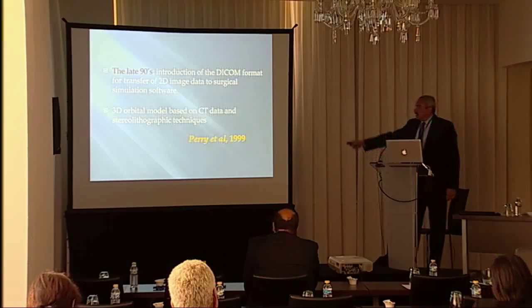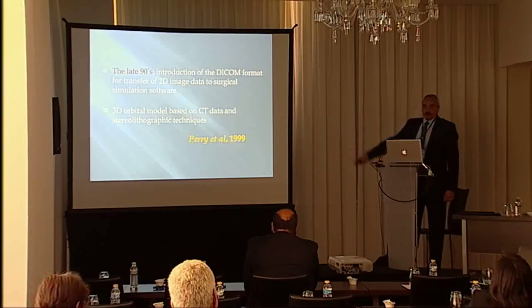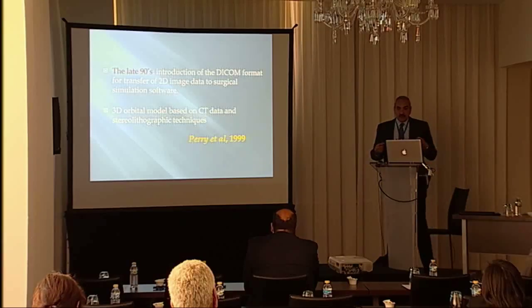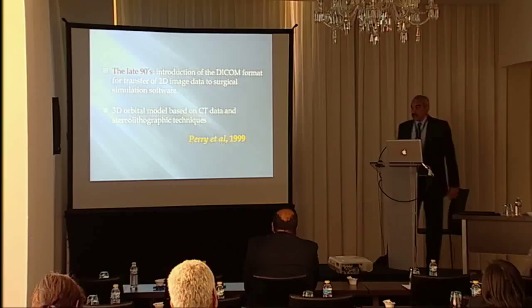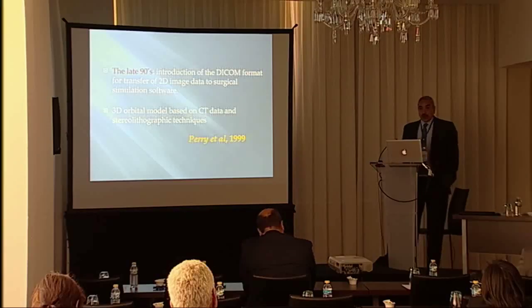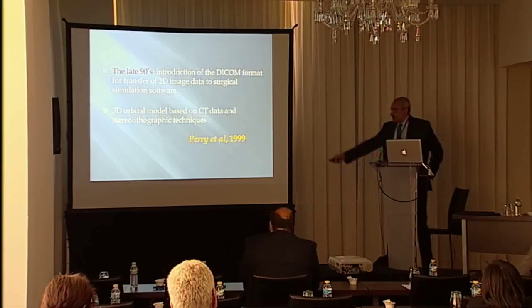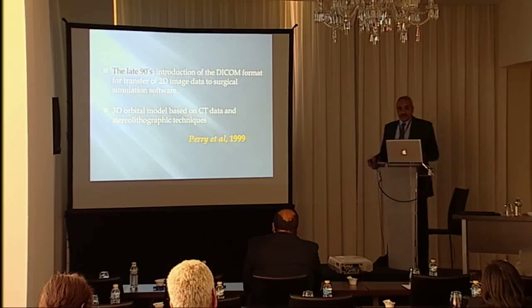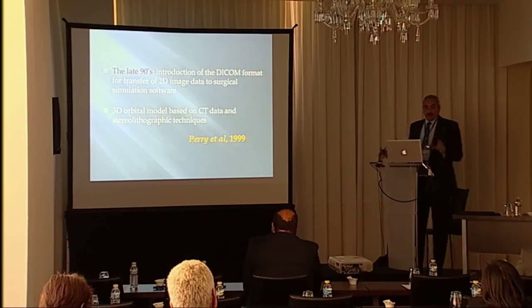But in the late 90s, with the introduction of DICOM file formats that allow the computers to import the DICOM files and make the 3D model electronically with simulation software, things started to go into action. And the study of Perry et al. actually pulled the attention of the whole medical industry to the abilities of 3D modeling.